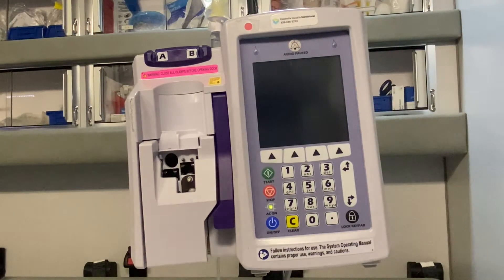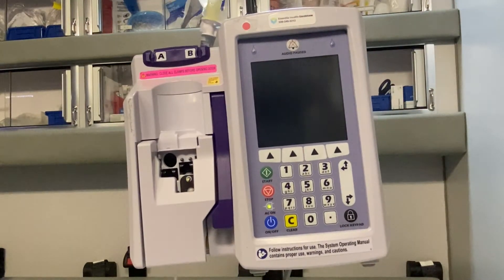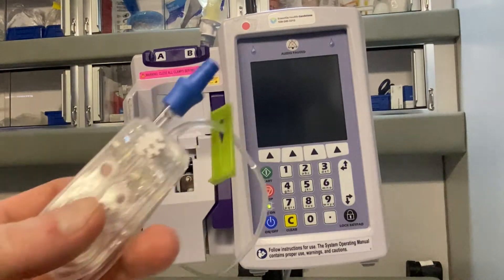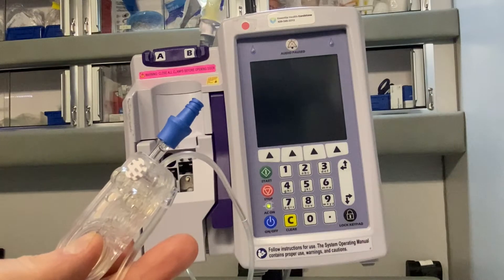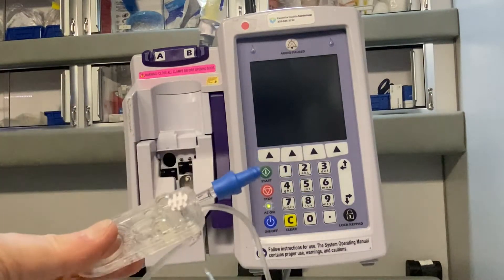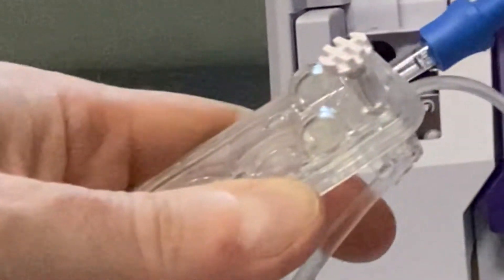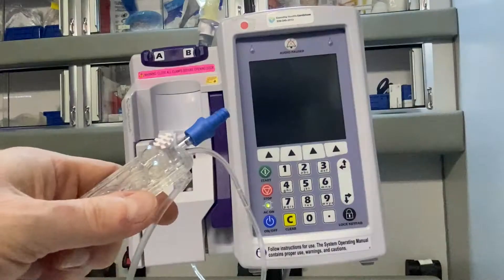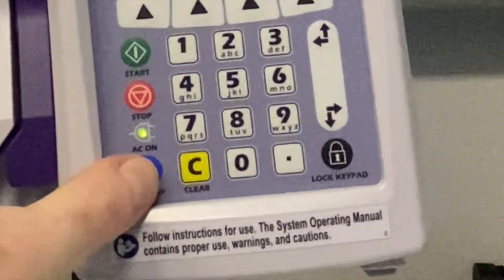I've taken the liberty of spiking a bag up here for our purposes. We'll assume it's a 250 cc bag. We did have to put on a special IV pump tubing — this is called a cassette. To bleed it, you pull this white tab out and squeeze the bag, and it bleeds and clears the tubing. With that ready, we want to turn on our pump.